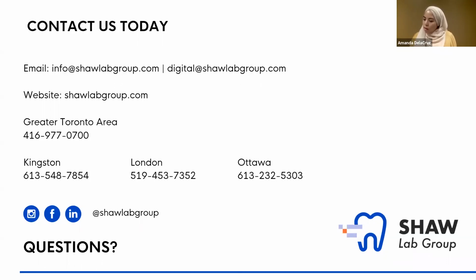And then I have a question about zirconia crowns. What kind of preparation is needed for a zirconia crown, and how much occlusal clearance do you need? Sometimes we do get knife edge margins for our zirconia crowns. I would not recommend it at all. Zirconia does require a chamfer margin, so the more that you can do that, the better your finish will be. The margins will be sealed. They're just meant to be a little bit thicker at the margin, so we don't recommend doing knife edge.